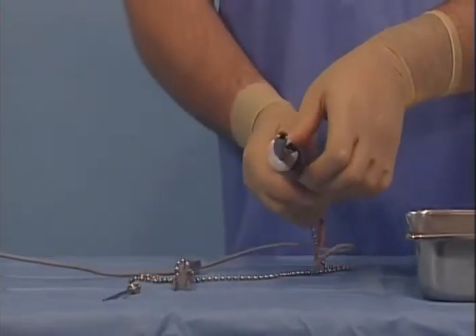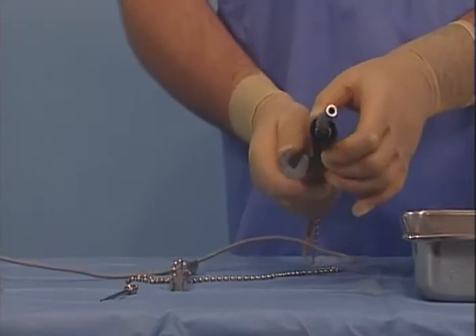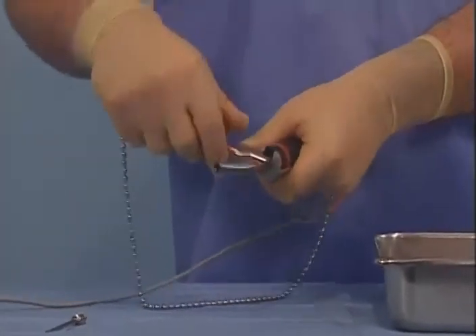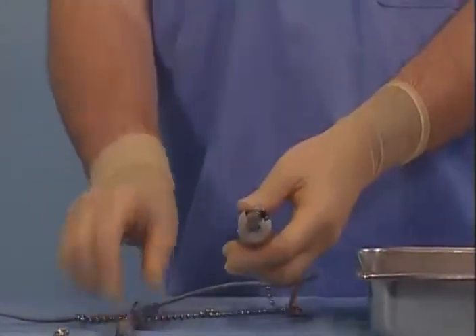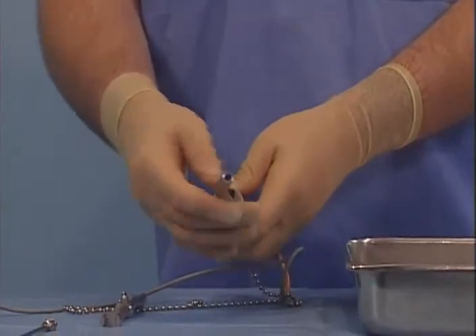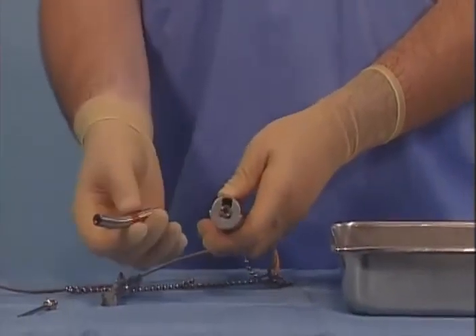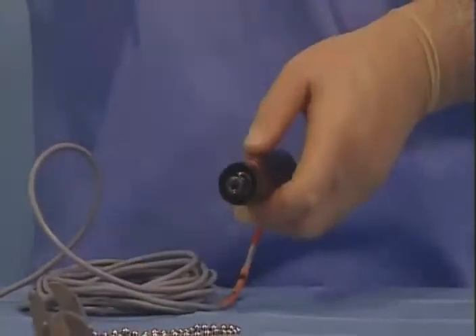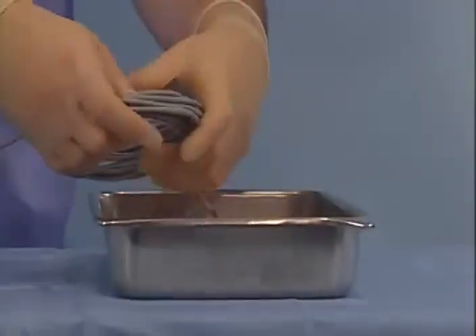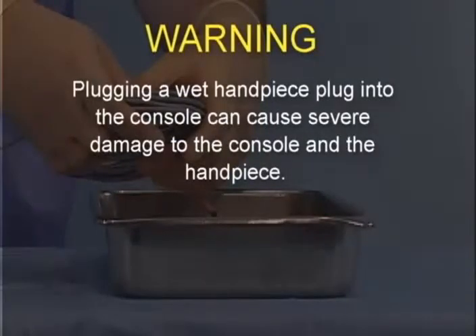Reposition the handle of the handpiece and secure flat 2 in the appropriate sized slot of the holder. Using the spanner, loosen the silver angled extension by turning it counterclockwise. Detach the angled extension and place it in the cleaning solution. Keeping the handpiece plug dry, place the handpiece handle and cord into the cleaning solution. Warning: plugging a wet handpiece plug into the console can cause severe damage to the console and the handpiece.